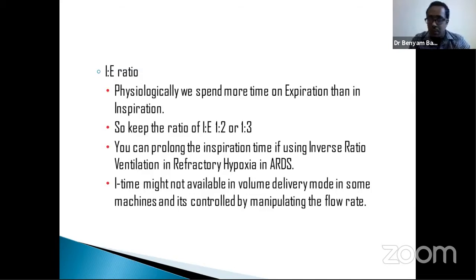The other one is to play with the FiO2. Usually we will raise the FiO2 to higher levels, but it's not recommended to keep it there for a long time. So that's basically what we can do with the ventilator. Or the other one is to manipulate the flow shape, making it decelerating rather than a box shape, so that it will be more physiologic and a higher percentage of pressured air will get in during initiation of pressure and be maintained for some time. So that is more specific to ARDS.